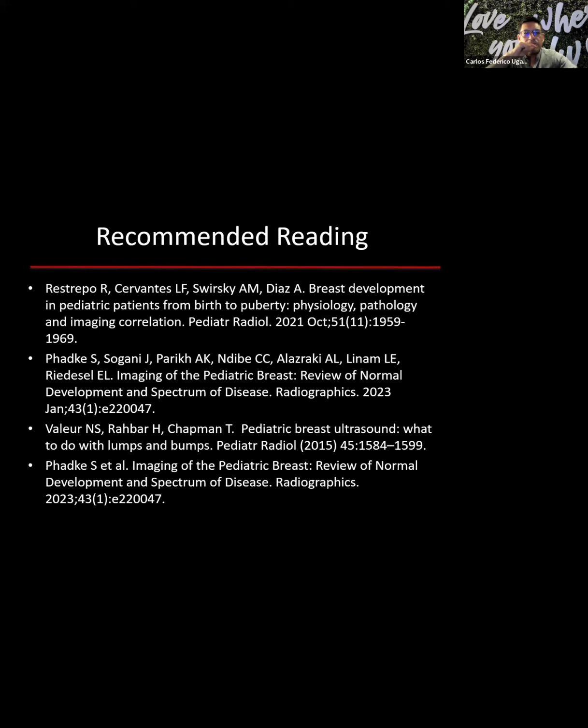Right. So we have another question from Juan. That's a good question. The question is that there are some lesions that resemble fibroadenoma in a young child, like a 6-year-old. Yeah. Again, fibroadenomas can happen in younger children. They are most commonly in teenagers, but if you see a solid mass that is small and well circumscribed and fairly uniform in its echogenicity and it has posterior acoustic enhancement, that's probably a fibroadenoma. So you could watch that even in the 6-year-old, again, as long as they don't have any prior history of cancer. So yes, fibroepithelial lesions can happen in youngsters, although less likely.